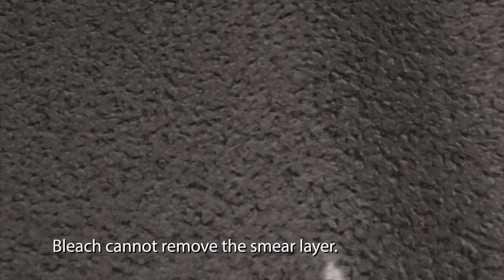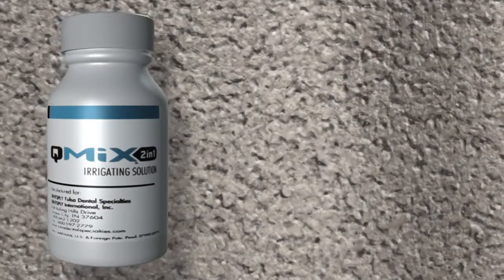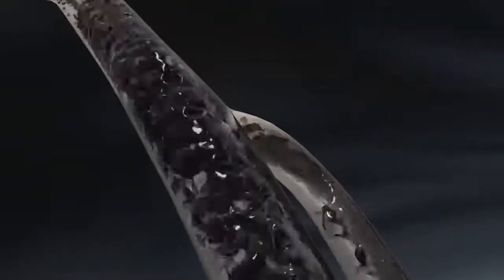While bleach is still a vital element of the irrigation process, it cannot remove the smear layer. Using Q-Mix as a final rinse after bleach effectively removes the smear layer, disinfects the root canal system, opens plugged dentinal tubules, and prepares the root canal system to receive the obturation material.